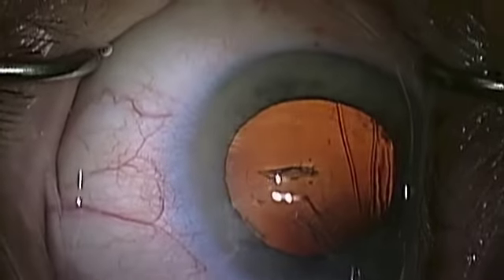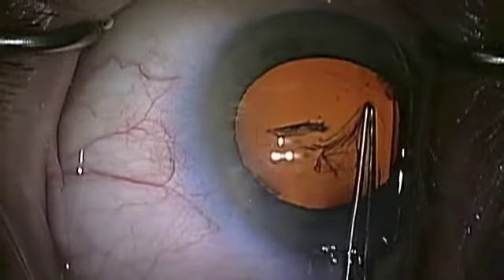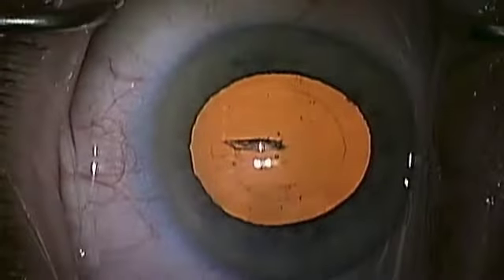This patient was able to fixate on the light very nicely, holding the eye still, making my job that much easier.